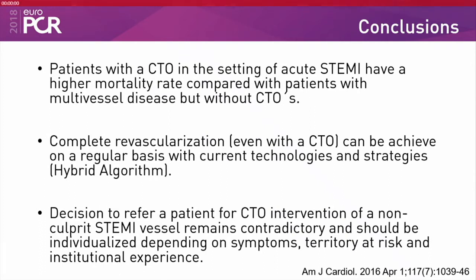Not any CTO, but in this setting, having a CTO and going into a STEMI of a non-related artery, those patients have better outcomes if you have opened the CTO previously than if you haven't. Maybe. So in this kind of setting, the patient would be different. I rarely do CTO on the right coronary artery, honestly. If the LAD is in question, then it makes sense.